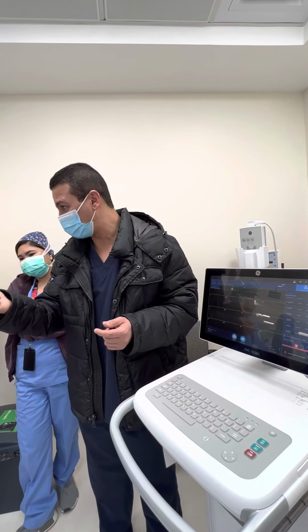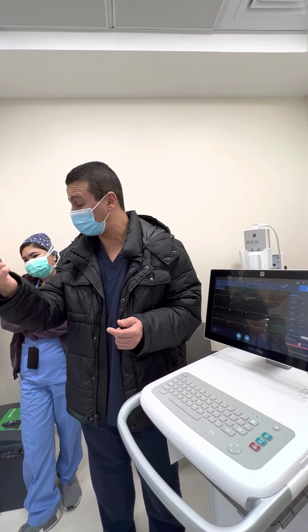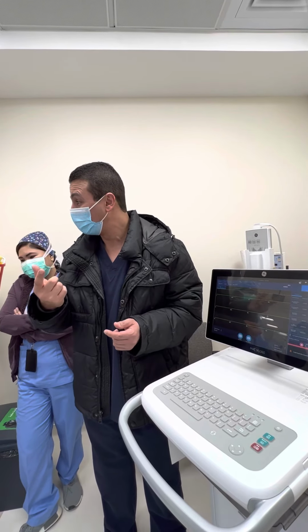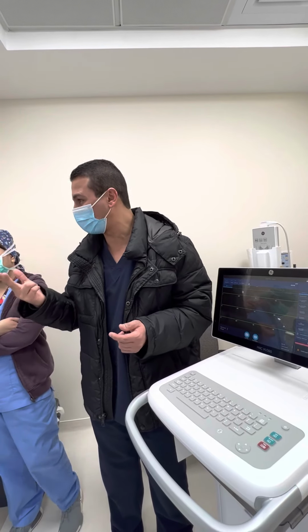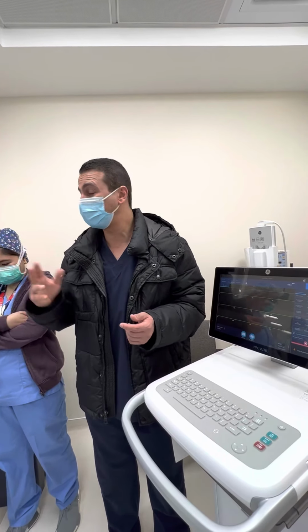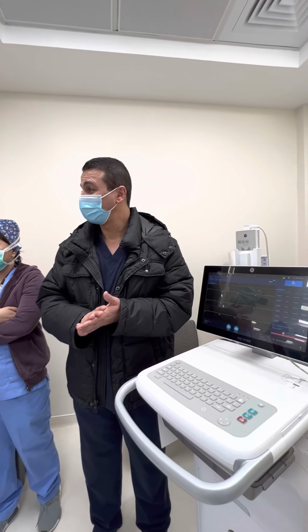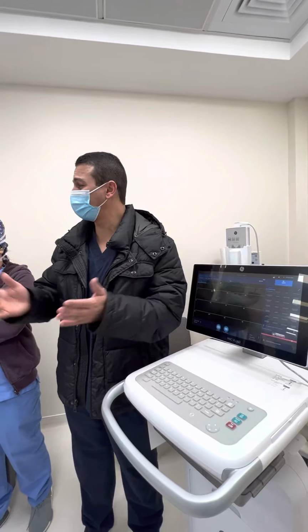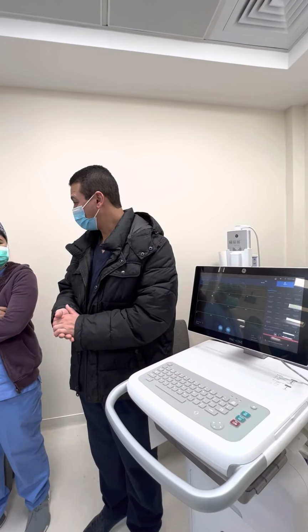That will reduce the printing out of papers and save your colleagues in the hospital time to do something else. So let's do the workflow, and also save the reports for our patients and their profiles, so as not to lose any report. Clear? Any further question, please?